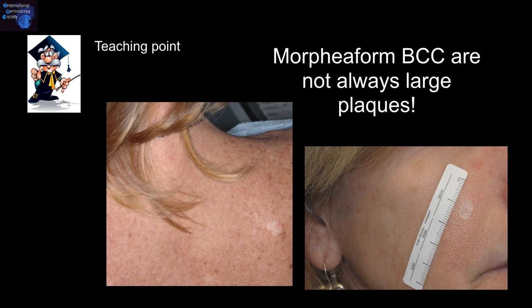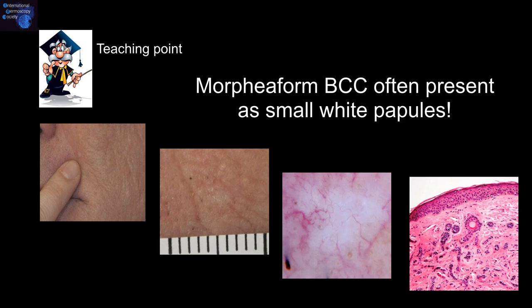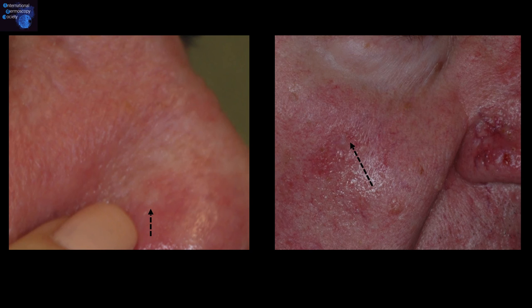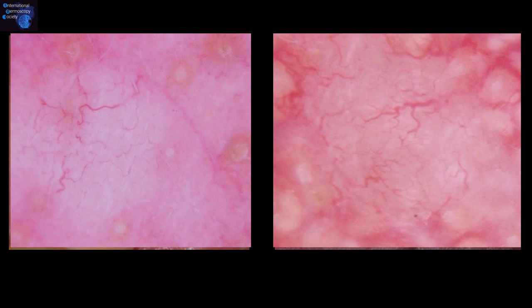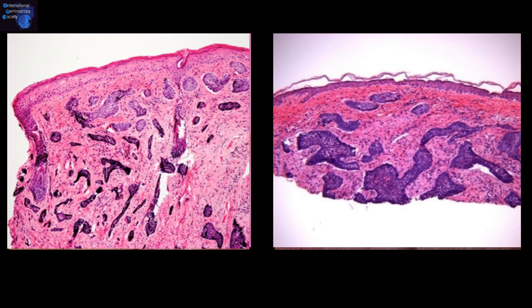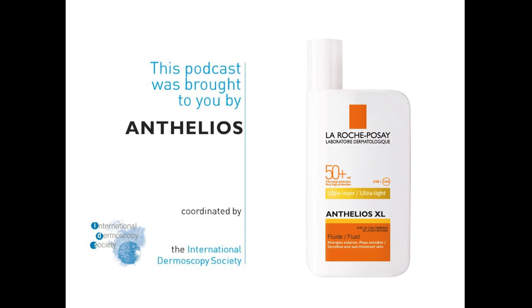An important teaching point is that morpheaform basal cell carcinomas are not always large plaques. Here we have an example of a white papule — a morpheaform basal cell carcinoma presenting as a small white papule. Two examples of small white papules clinically and dermoscopically show the milky white appearance with serpentine branch vessels, and an infiltrative pattern on pathology. To be continued.